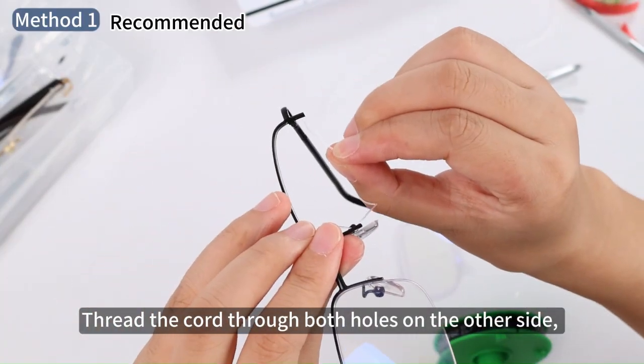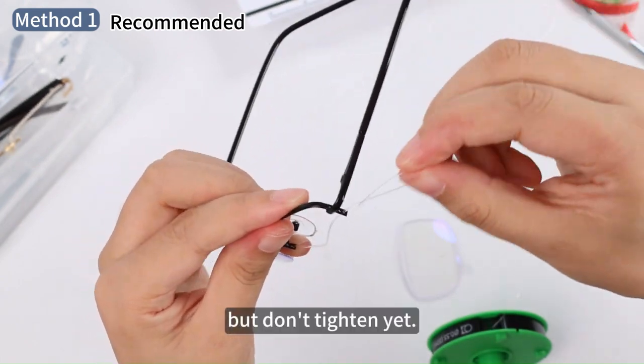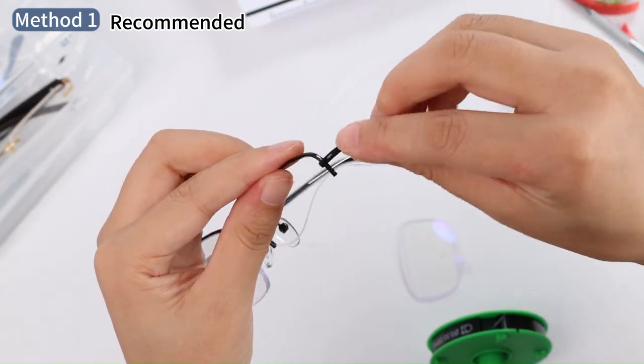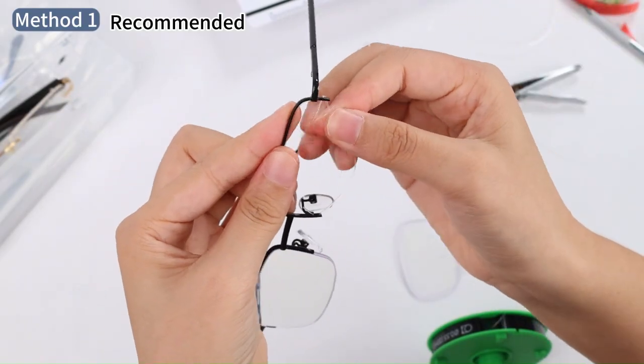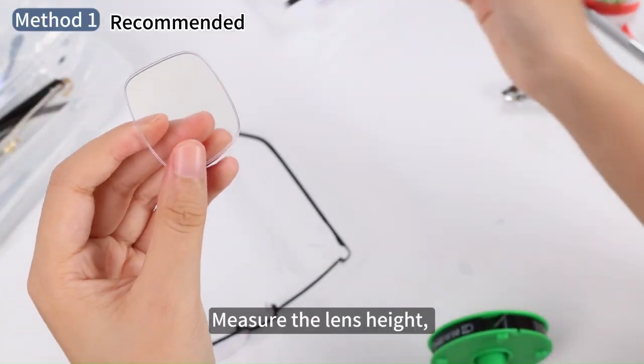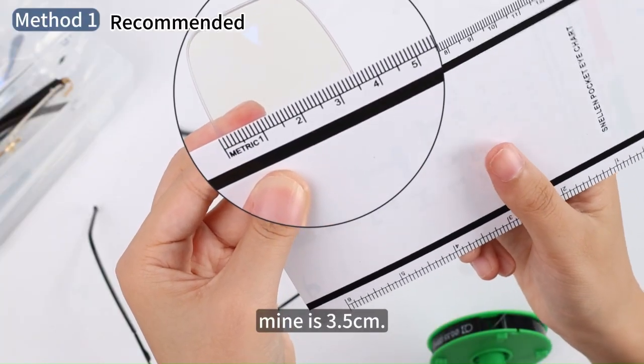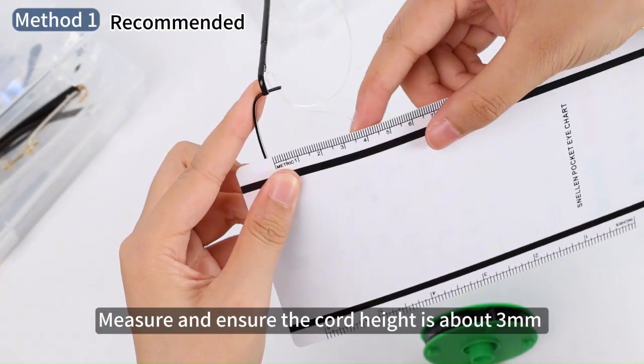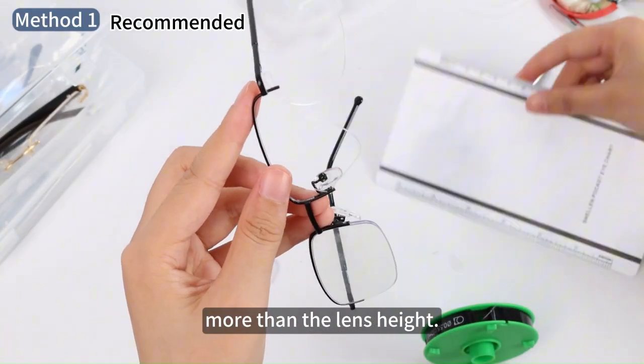Thread the cord through both holes on the other side, but don't tighten yet. Measure the lens height. Mine is 3.5cm. Measure and ensure the cord height is about 3mm more than the lens height.